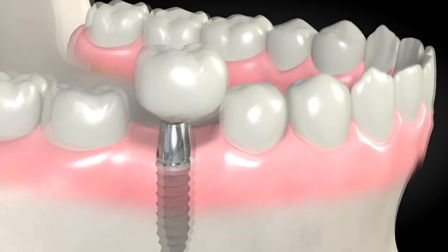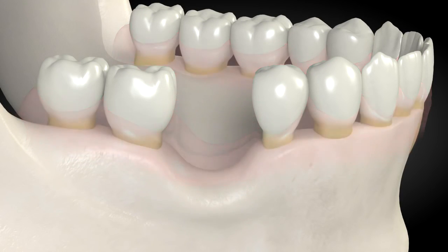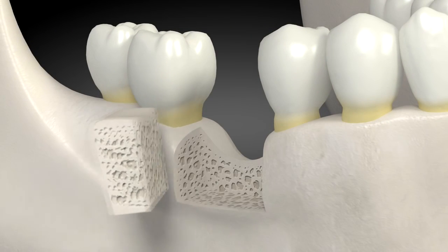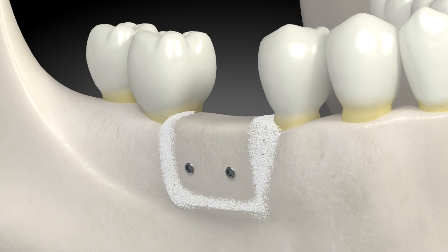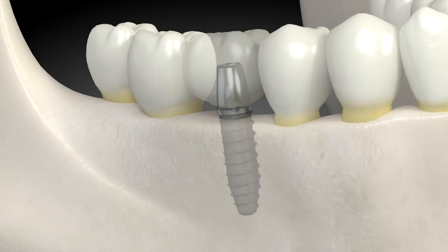A tooth is placed on the dental implant. For patients that have more bone missing, a technique involving placing blocks of bone in the area with missing bone works well. The blocks are shaped to the desired size and placed with titanium screws. They are left to heal for 4-5 months, after which there is plenty of bone for a dental implant.